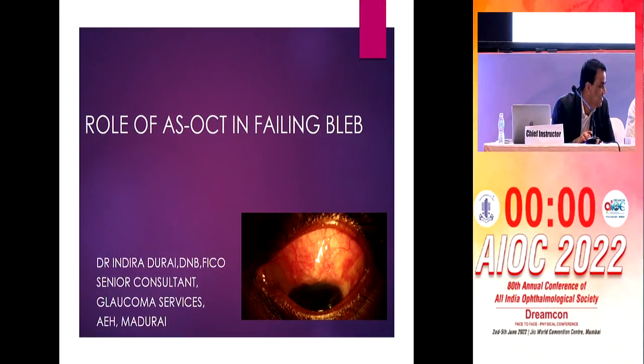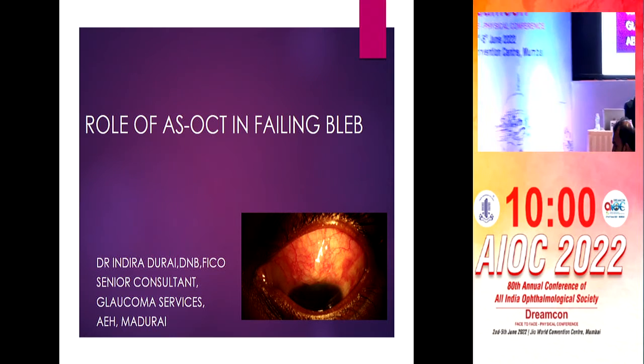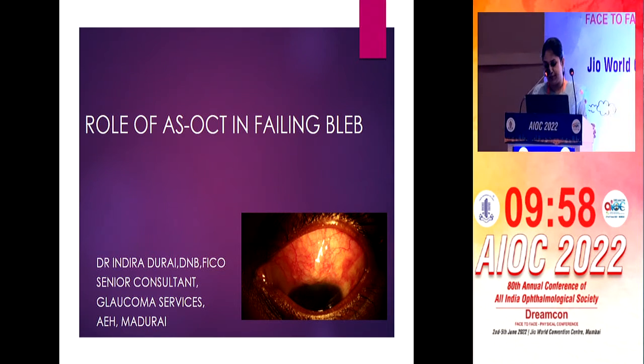Good afternoon, everyone. At the outset, I'd like to thank Dr. Devendra sir for this opportunity. I'll be discussing the role of anterior segment OCT in identifying failing blebs.